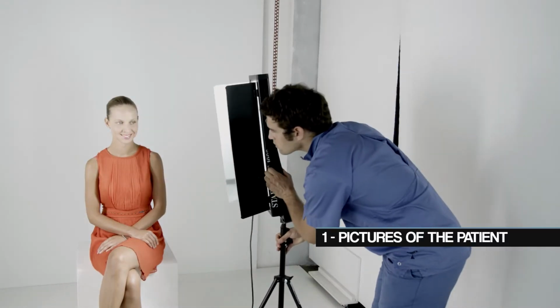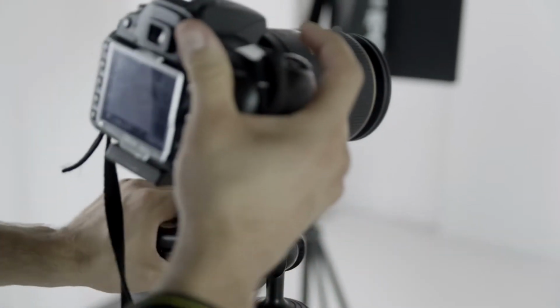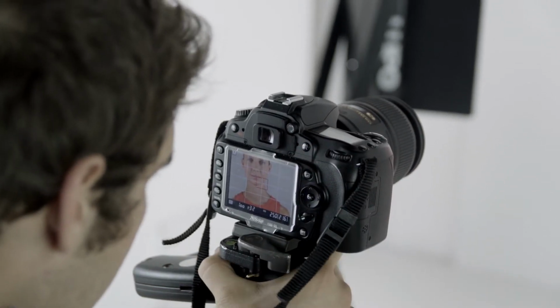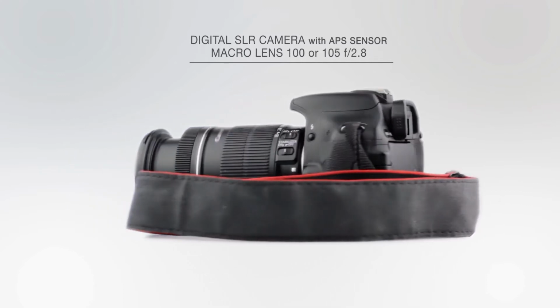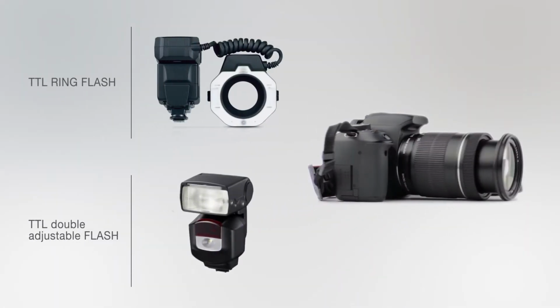The first step is acquiring videos and photos of the patient. The ideal solution is to prepare a photography studio right within the dental office itself, with movable polystyrene walls, fixed lights, and tripod. Of course, you can always shoot professional photos in any area of the office using simple ring flashes and the integrated flash on digital reflex photo cameras.